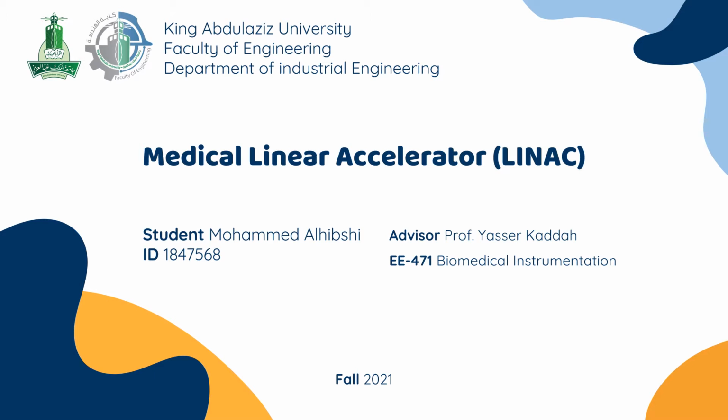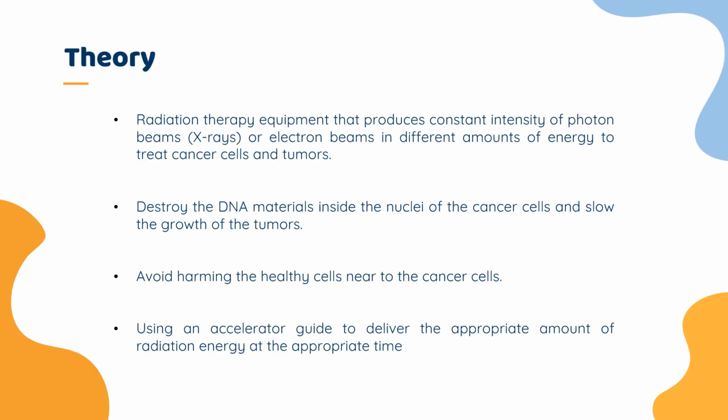Today I will present the theory, instrumentation, and some technical specification of the medical linear accelerator. The theory behind the LINACs. A medical linear accelerator, LINAC, is a radiation therapy equipment that produces constant intensity of photon beams, X-rays, or electron beams in different amount of energy to treat cancer cells and tumors.